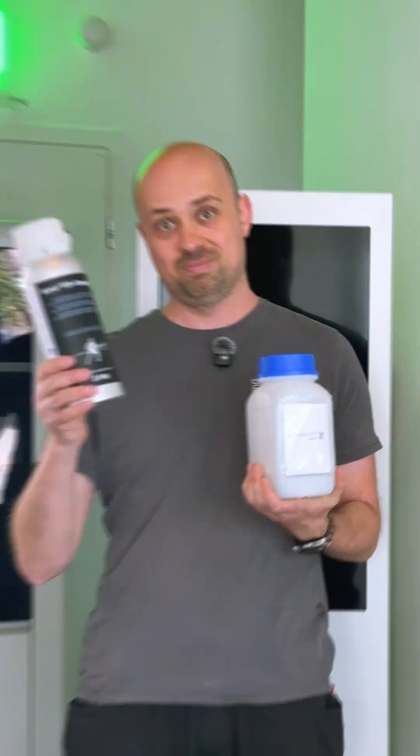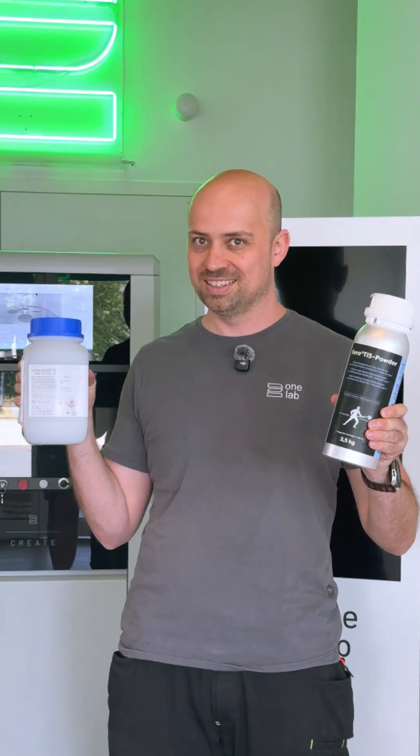You are printing with Cobalt Chrome and you want to switch to titanium? No worry, it's very easy. Hi, I'm Markus from 2onelab and today I want to show you how to switch from Cobalt Chrome to titanium.